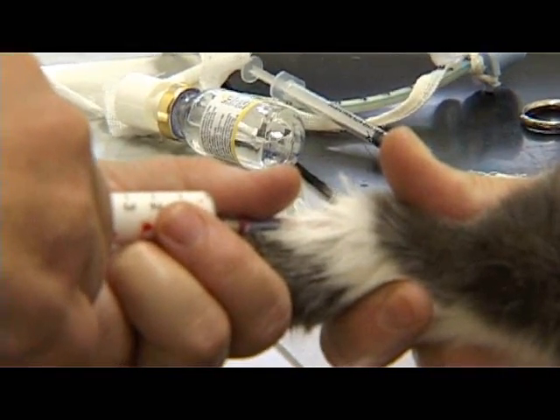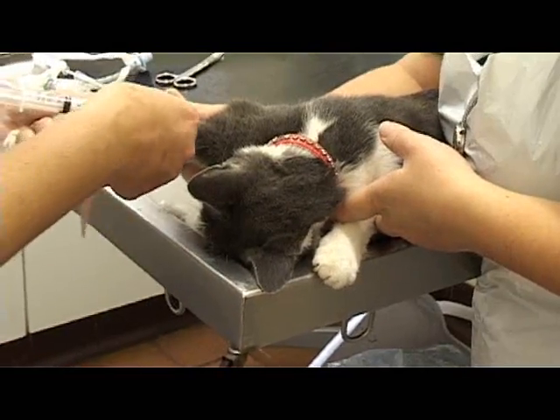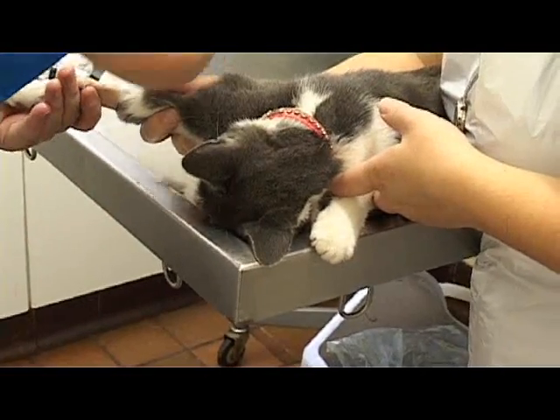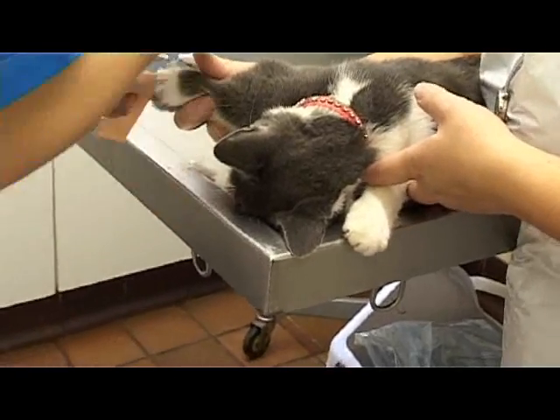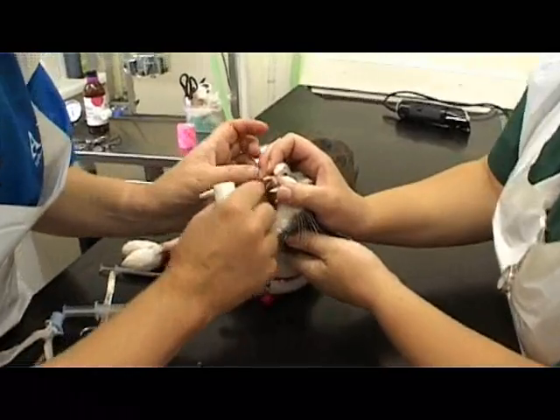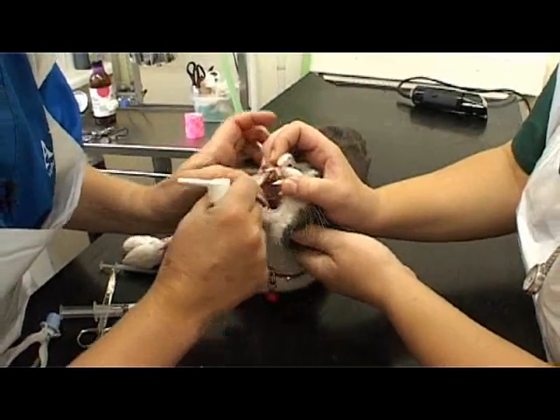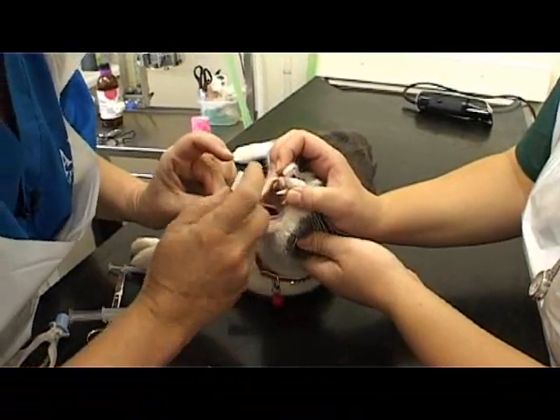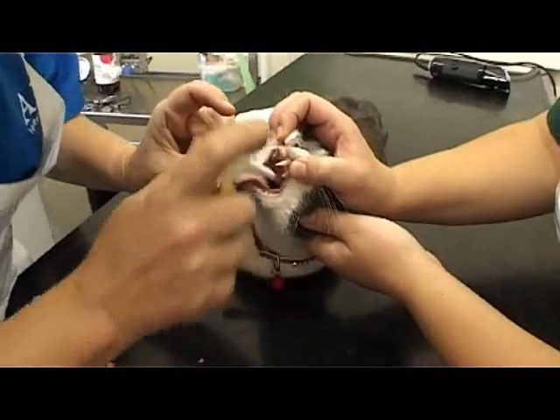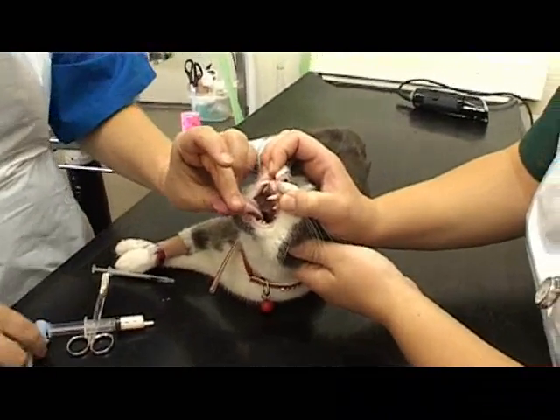That's what we've removed. You go off to sleep, Puppet. That's Macy asleep. Let's just strap that in case we need a vein for anything later. We'll need to give her any more. Macy's just over a year old so far as we know. She had a litter of kittens 12 weeks ago. That's a local anaesthetic.